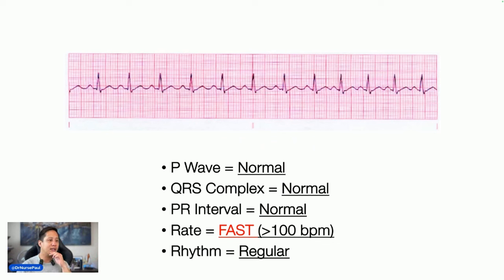All right? Sometimes it's dehydration. In the ER, we just give them a bag of fluids and boom, everything looks good, right? That's not usually pathologic. Sinus tachycardia usually is just a compensatory mechanism, right? But that's it, and there are many causes. Oops, my screen froze again. Okay, well, let's go to the next one, guys. That's sinus tachycardia.